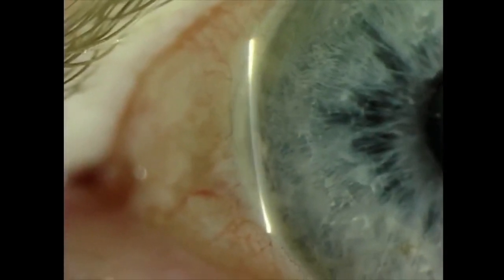This is a narrow chamber. You can see that the anterior chamber depth is much thinner than the corneal thickness, and that there are actually areas where the iris appears to touch the cornea. So that's the thickness of the cornea, just a very thin anterior chamber here, and areas of touch.